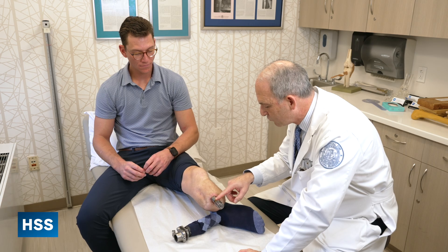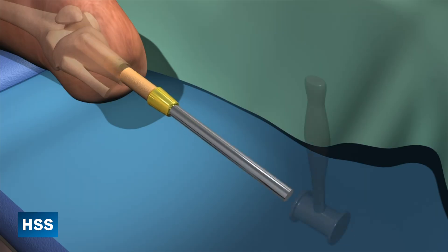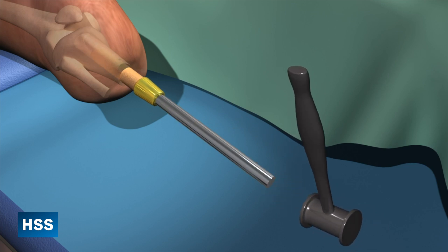The aperture may seem scary — there's a kind of hole in the skin and the device comes to the outside world as the connection point to the prosthetic. But the aperture is well tolerated the vast majority of the time. It's like a piercing: people have an earring with a hole in their skin that develops a relationship with a piece of metal. In the beginning it might be a little red or irritated, but it's very high-quality metal and in the end it is generally very well tolerated.